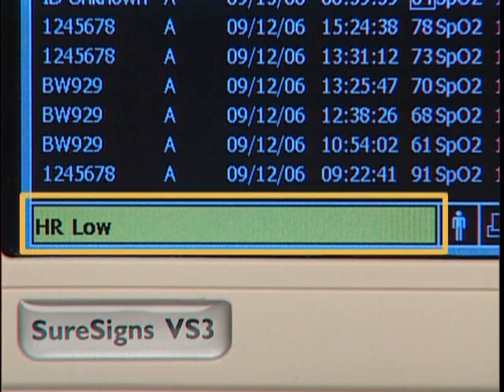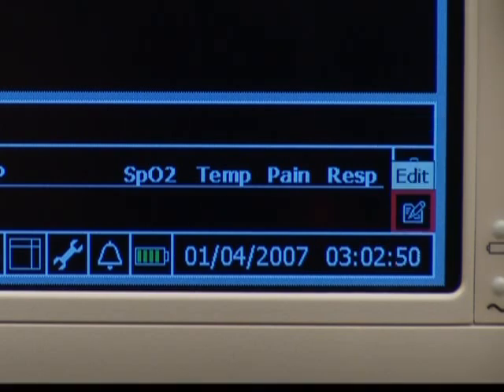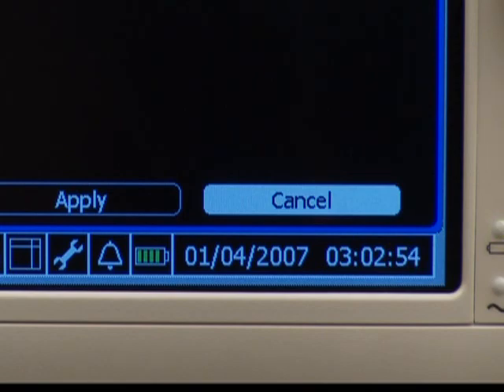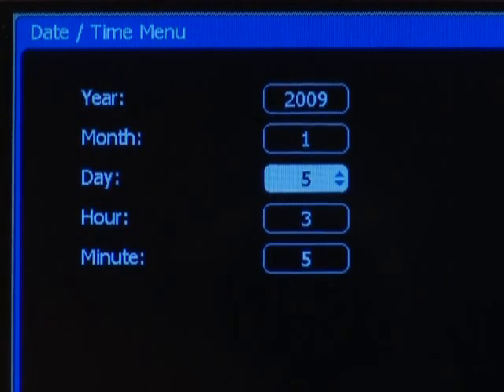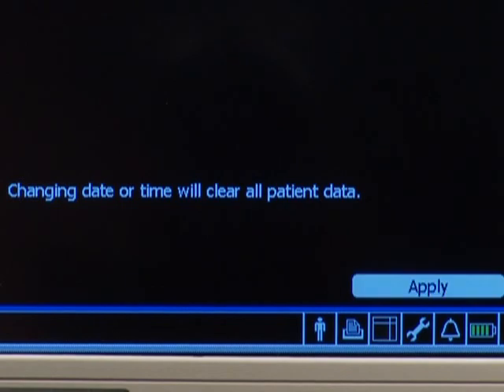This area displays text descriptions of any active alarms or error messages. To change the monitor's date and time, highlight and select it on screen. Highlight and select one of the items in the menu and then turn the wheel to change it. To accept the change, select it again. Note that making changes to the date or time clears the stored patient records. When finished, highlight and select Apply.